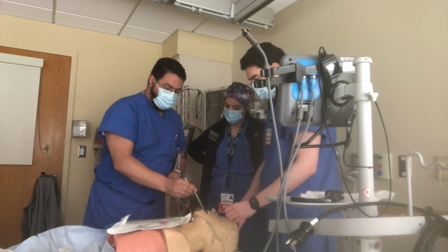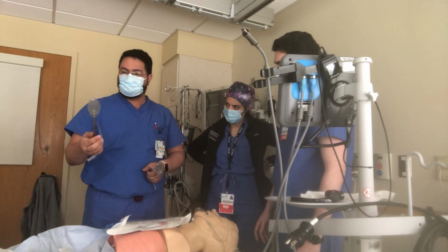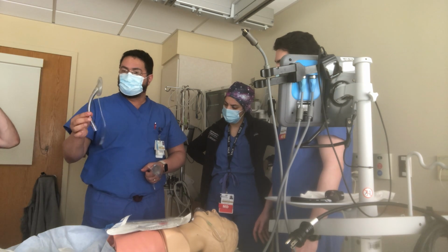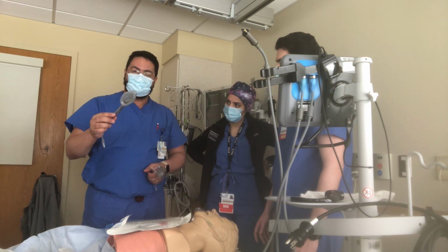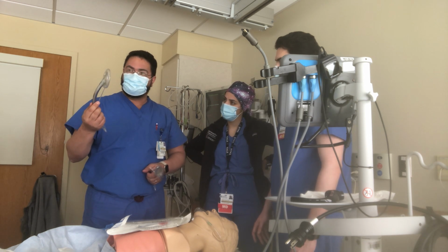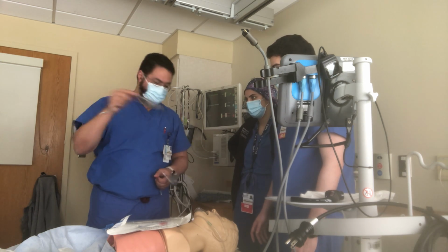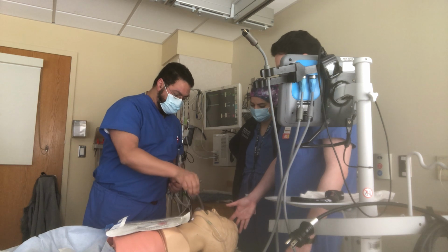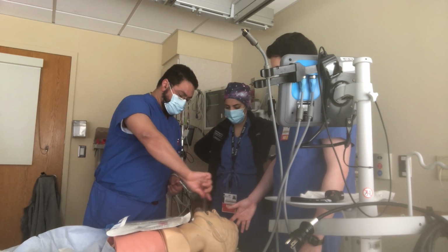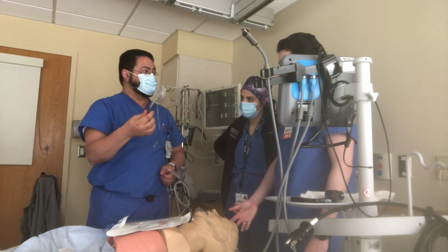But if you are not able to do this, I did this thing at Harvard Medical School. I told the kids over there, if you don't know how to do this, you can just take this and shove it, like literally shove it like this. If you shove it halfway, it's gonna work. If you shove it upside down, it's gonna work. If you shove it sideways, it's gonna work. It is the best thing that was invented.